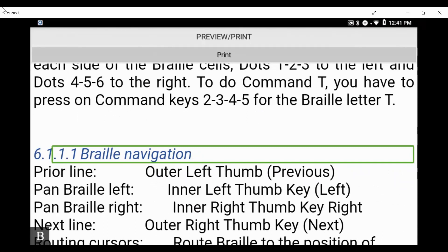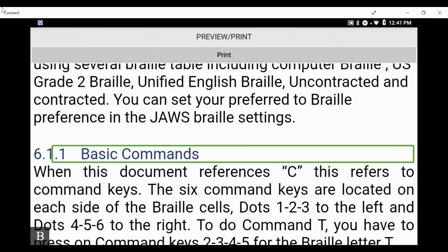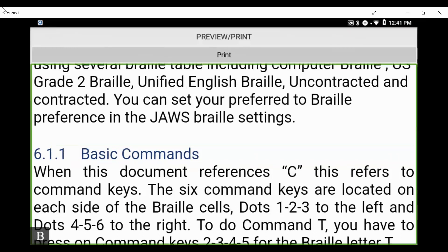Pressing H again: 'Six dot one dot one dot one, Braille navigation, heading four' — various heading levels allow you to quickly jump to different parts of this document. If I want to go back a heading I add backspace and enter to my command — so H for heading, L for link, with backspace and enter to go backwards. Pressing backspace-enter-H: 'Six dot one dot one, basic commands, heading three' — we went back.